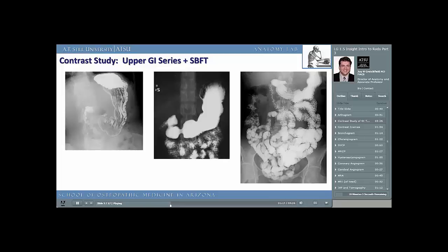There are several risk factors associated with upper GI series and or small bowel follow-through studies. They are still commonly used today, giving the physician a significant amount of information on the function and pathology of the patient's internal organs. But it often does so at a price. If aspiration of the barium into the lungs occurs, it can cause severe respiratory compromise and even death. Like the bronchogram, shown in our next slide, aspiration of the barium sulfate is usually non-lethal because it is not absorbed and the patient can simply cough it up and out. However, if enough barium is aspirated, it can cause death and respiratory compromise.